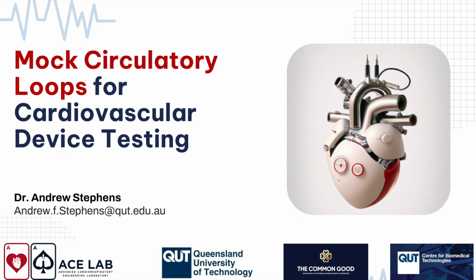Another really important component in our Windkessel model and in our mock loop is compliance. So compliance is basically the springiness of the vessels as the blood travels through. And you can feel this in your pulse, right? The thing that you actually feel when you're feeling your pulse is the vessel expanding and contracting due to the changing pressure caused by the ejection of the heart.